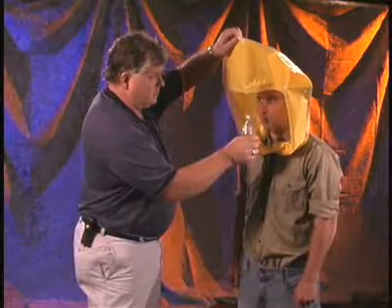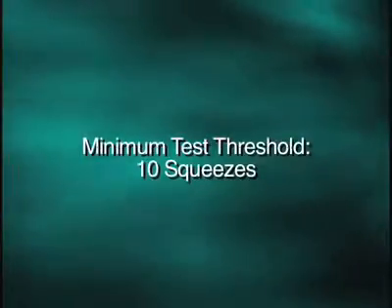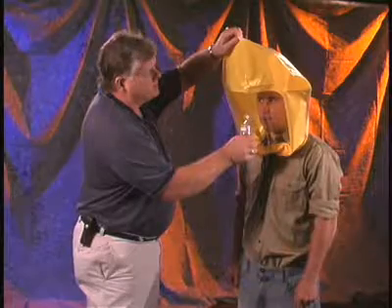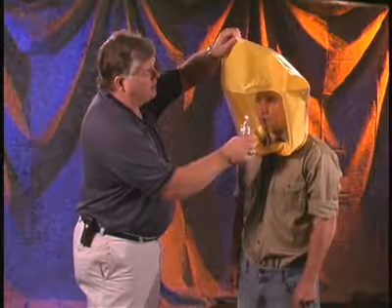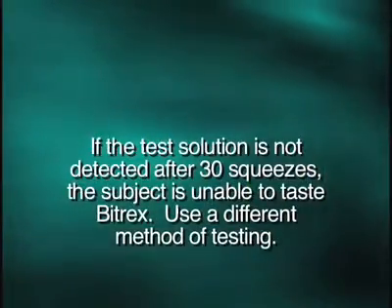Ask if the subject can detect the bitter taste of the test solution. If tasted, note the number of squeezes and proceed to the fit test. The minimum test threshold is always noted as 10 squeezes. If the subject has not yet tasted the solution, repeat with 10 more squeezes of the aerosol. Repeat with 10 more if the solution is still not tasted. If the test solution is not detected after 30 squeezes, the subject is unable to taste Bitrex and will require a different method of testing.